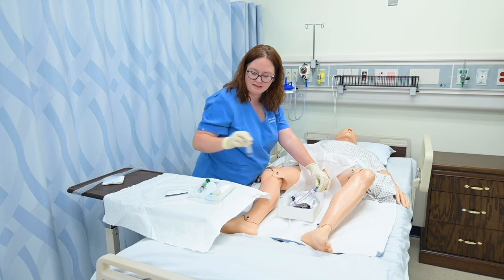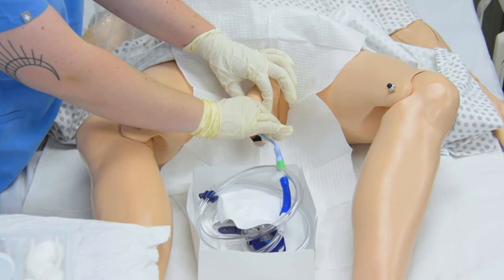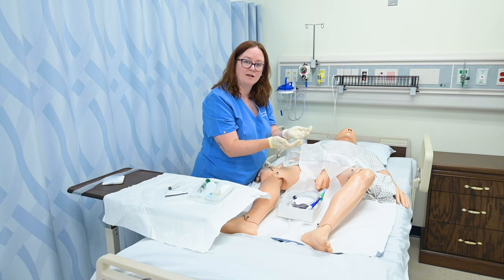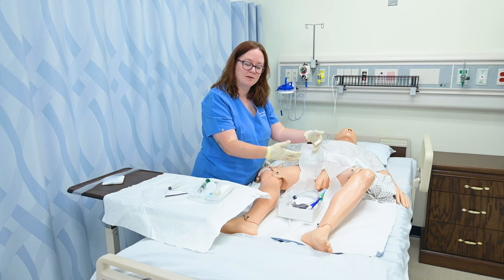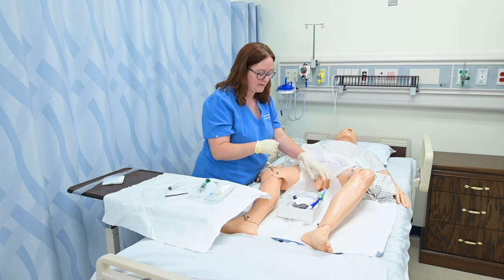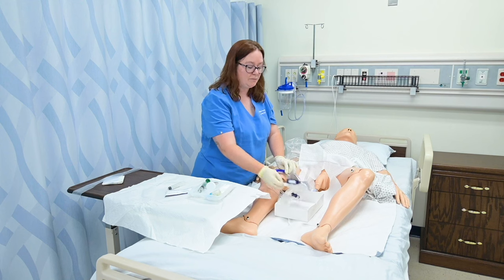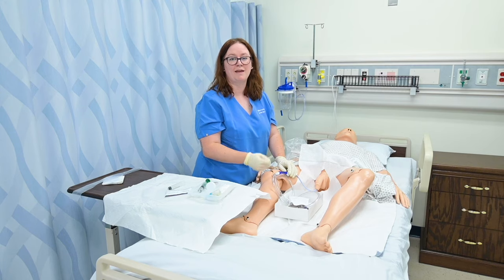Once my balloon is inflated I can detach that syringe and then gently pull on the tube. I tug very gently just to make sure it's secure and that the balloon has settled at the exit of the bladder that connects to the urethra, so that no urine can leak around the balloon and come out through the penis — I want all the urine to go into the catheter. Once that's done, I simply need to attach the catheter to the leg using some type of anchor, attach the bag to the bed below the level of the bladder, and clean up my items. And that's how you insert an indwelling catheter on a male patient.